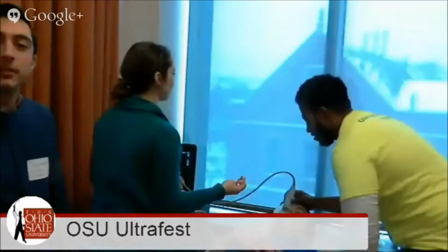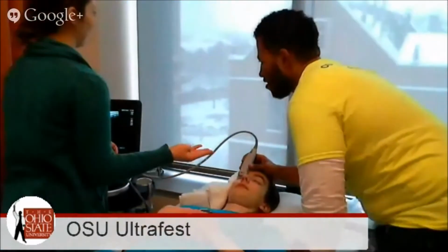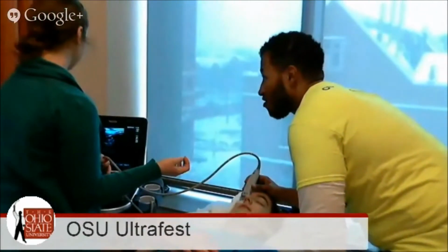You have to get the angle just right, and you'll see the iris and see the pupil and shine the light. It takes longer and your eyes closed.